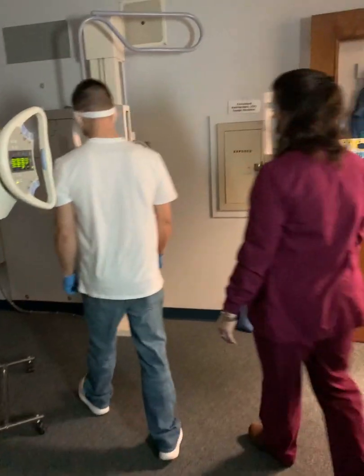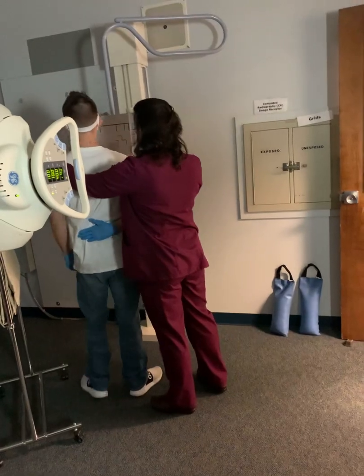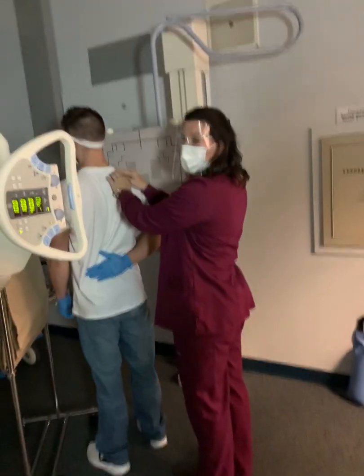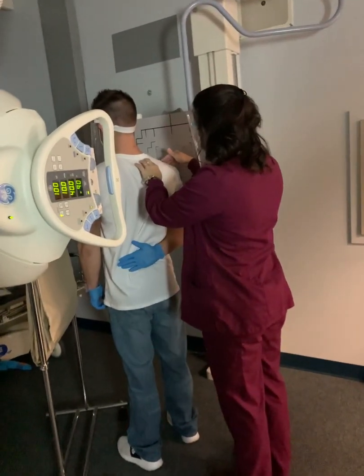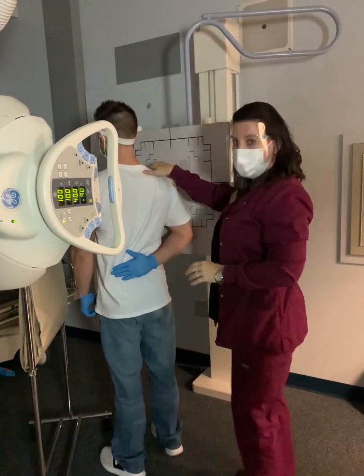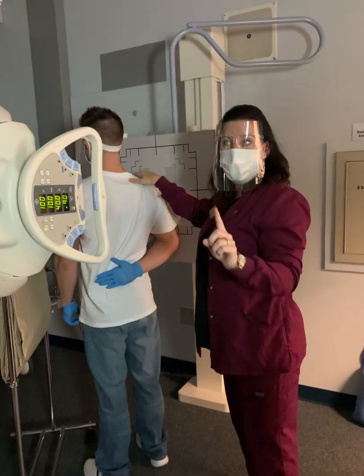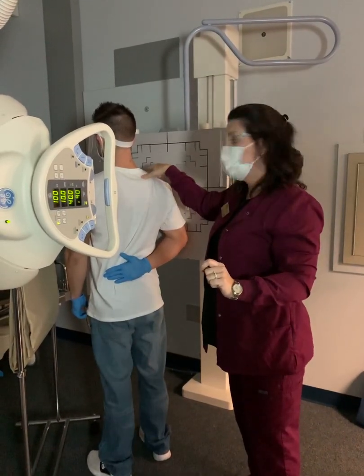So let's put you back up here. We're going to put your arm back behind your back. I'm going to turn him at an angle. What am I lining up? What did you line up for your scapula? Top of the scapula and then the AC joint and the superior angle of the scapula.